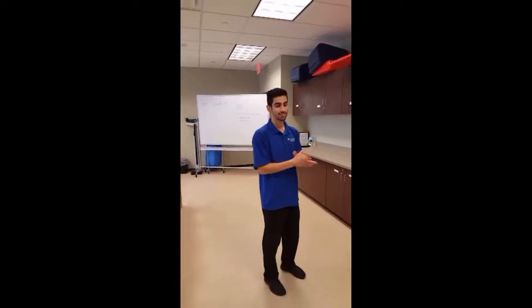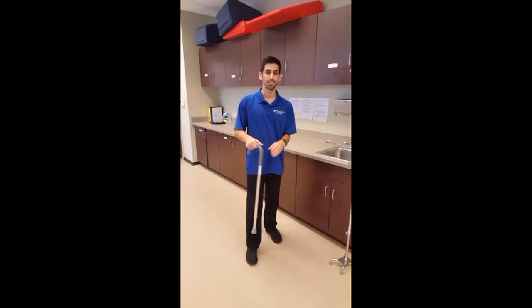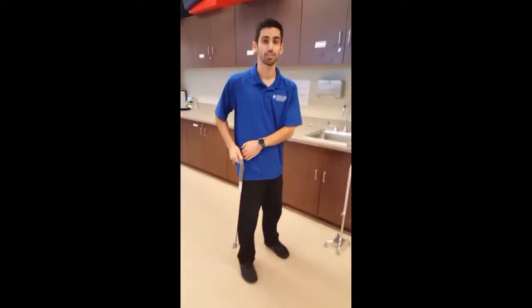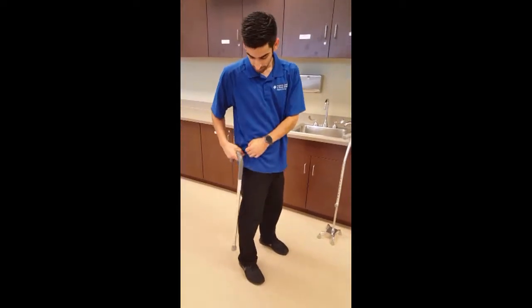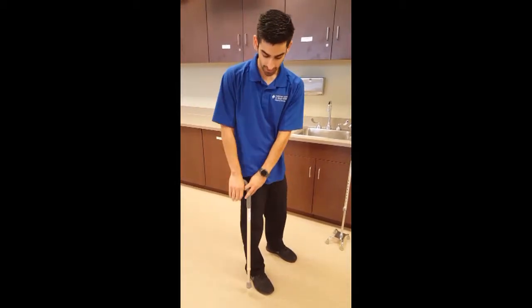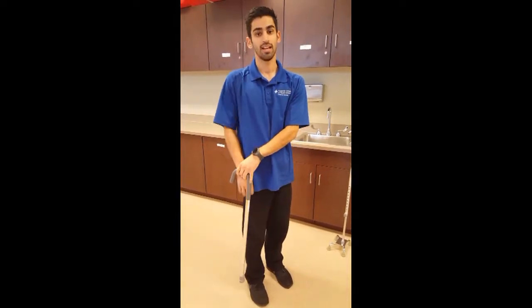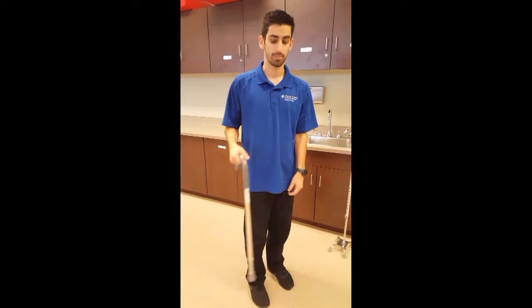When it comes to fitting a device for a patient, as a general rule, you want to make sure that the hand grip is at the level of the greater trochanter, which you can palpate right here at the upper thigh, with their back straight, looking straight. If the hand grip is at their ulnar styloid, then the assistive device is at the right place.